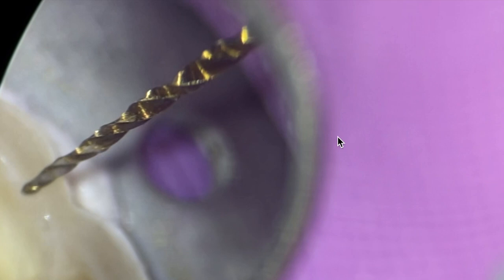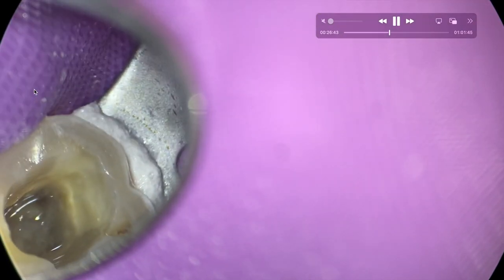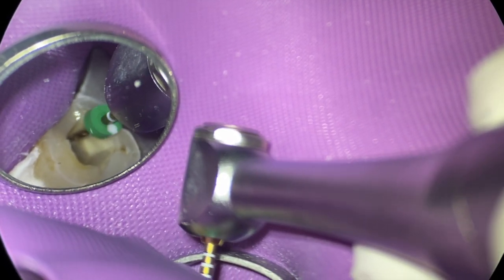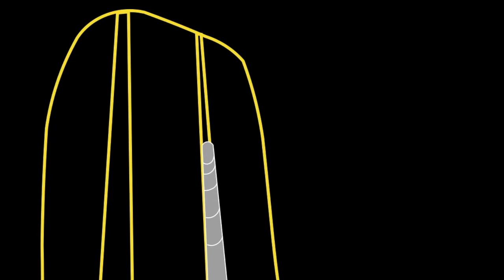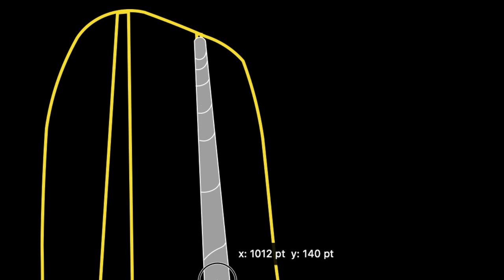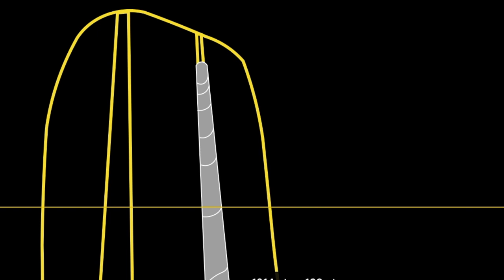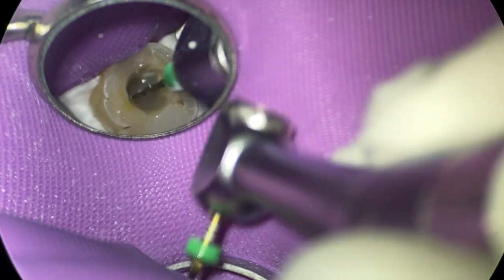I put this in the video because this is one of our proxy indicators to know when to stop cleaning and shaping your canals. Put in the comments below if you do this. What I'm looking for is debris on the apical portion of my flutes. That's the mental game where I'm kind of like, okay, I need to take a mental break. Let's clean and shape all these other things to keep the case progressing. Here you can see I'm stopping. I've got apical debris in the apical flutes. I'm like, yep, I'm going to stop there. What does that mean? Well, it means you're machining the inside of that canal to an adequate—all the walls are scraped and we're decreasing biofilm and getting rid of vital tissue.